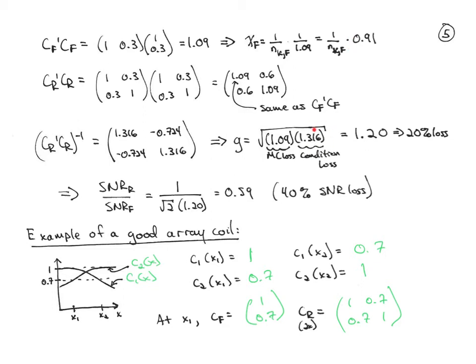Here we designed a coil that gave us overall lower G factor. And what we're going to see with this one is that we get an improved value for the fully sampled case, but a worse value for the G factor, because we have now tried to design a coil that is better as an array coil, where we have more sensitivity everywhere from every element, versus a SENSE coil where we have more sharply defined coil sensitivities that are better localized.